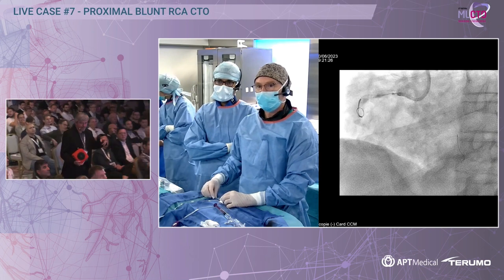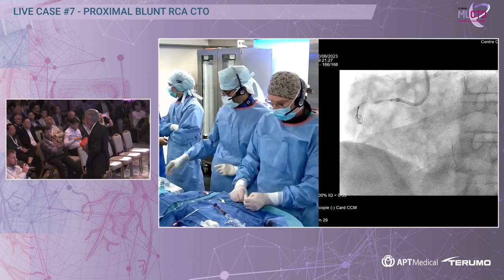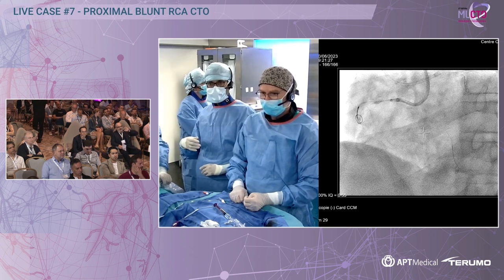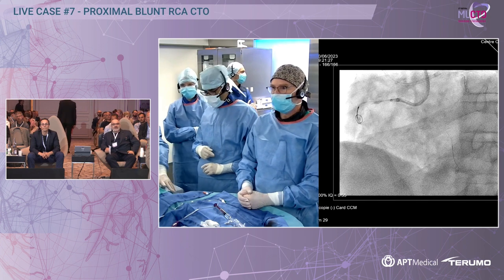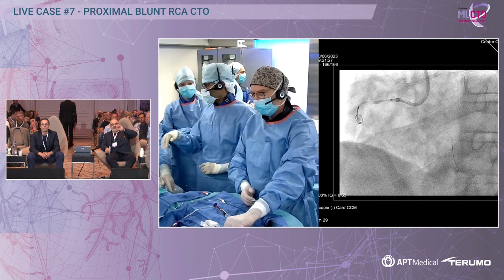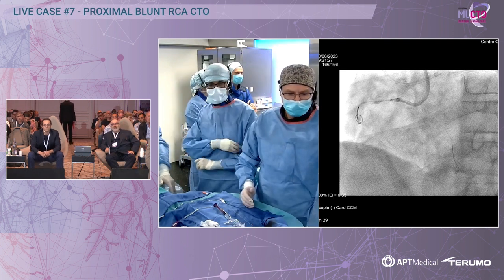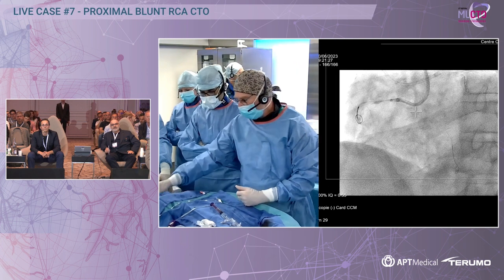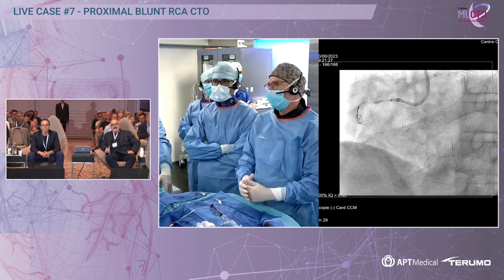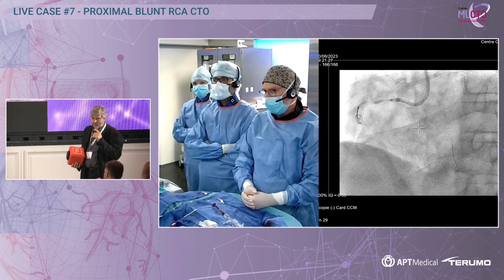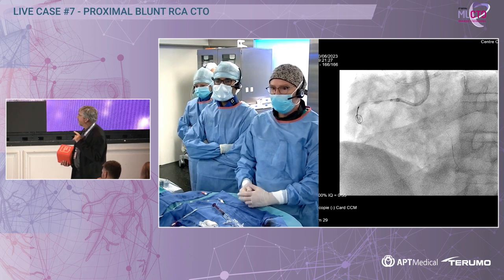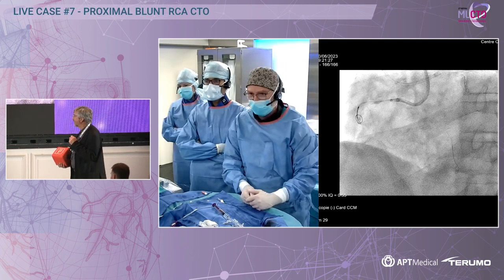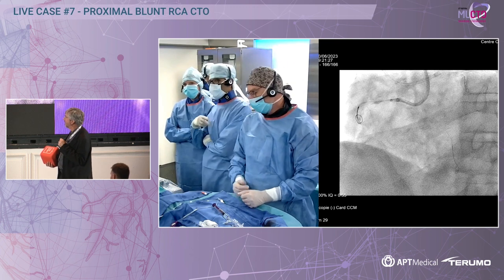Alexander, you went directly with the Gaia Third because you felt you needed to puncture. I would have been tempted to go with something like an XTA first to see — at the end of your injection there was almost a little rat's tail. With a softer wire you might have had a better chance of getting in the true lumen rather than a hard wire that's more likely to go subintimally. Okay, I understand your point of view, but I'm very confident with the Gaia Third and my tactile feedback is good with this guide wire. I can tell if I'm intraplaque or extraplaque.